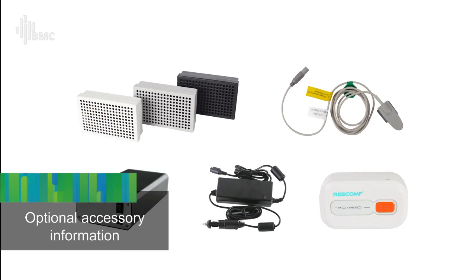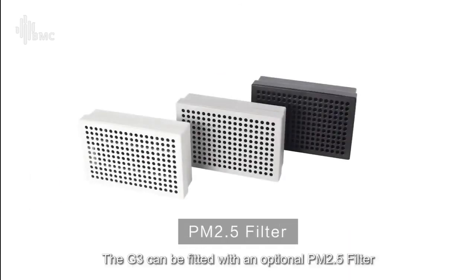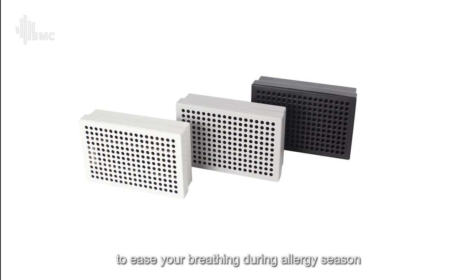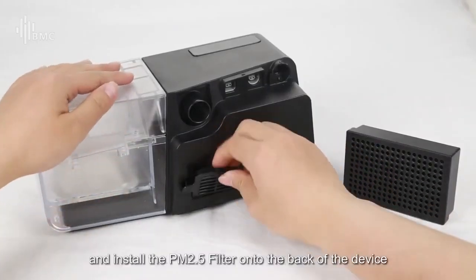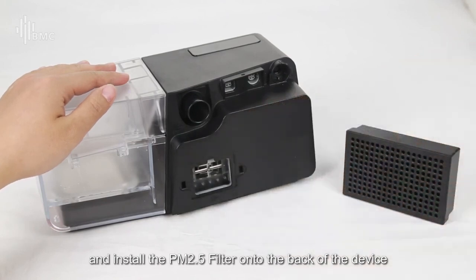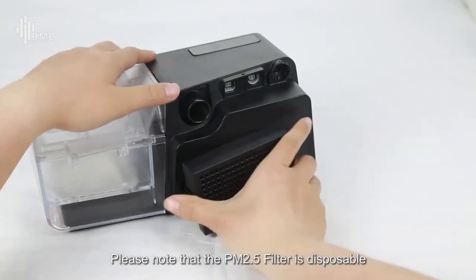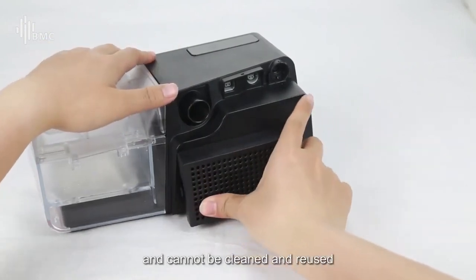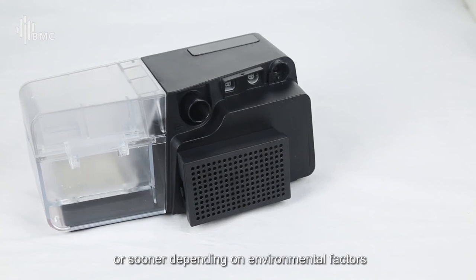Optional accessory information. PM 2.5 filter. The G3 can be fitted with an optional PM 2.5 filter to ease your breathing during allergy season or in highly polluted environments. Remove the regular filter and install the PM 2.5 filter onto the back of the device. Please note that the PM 2.5 filter is disposable and cannot be cleaned and reused. Replacement time for the PM 2.5 filter is 6 months or sooner depending on environmental factors.